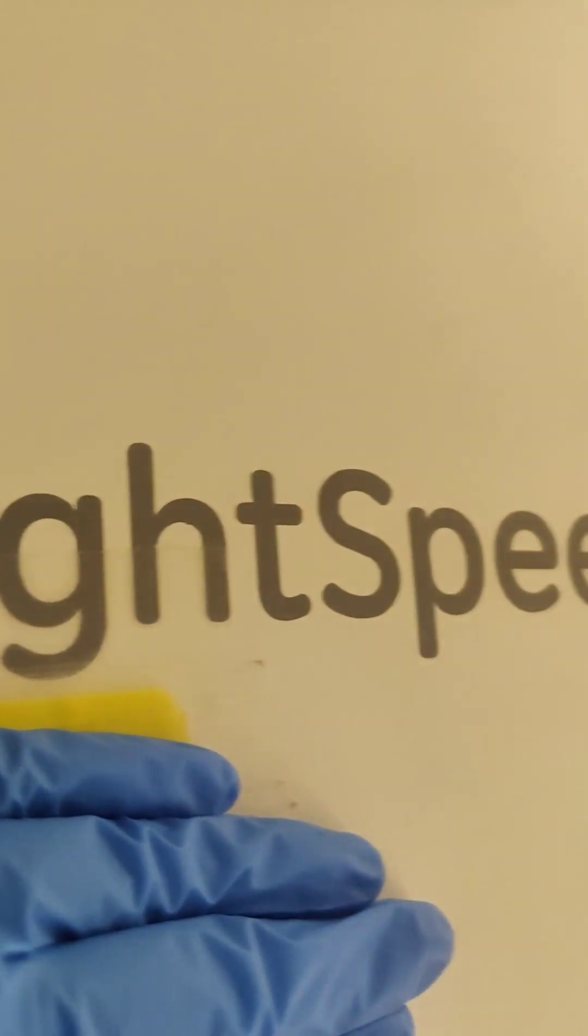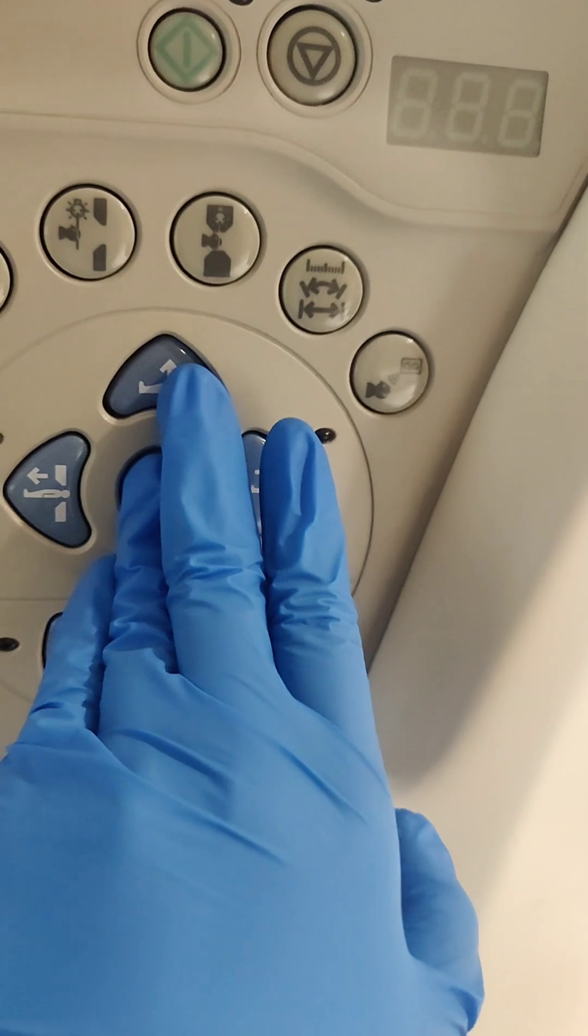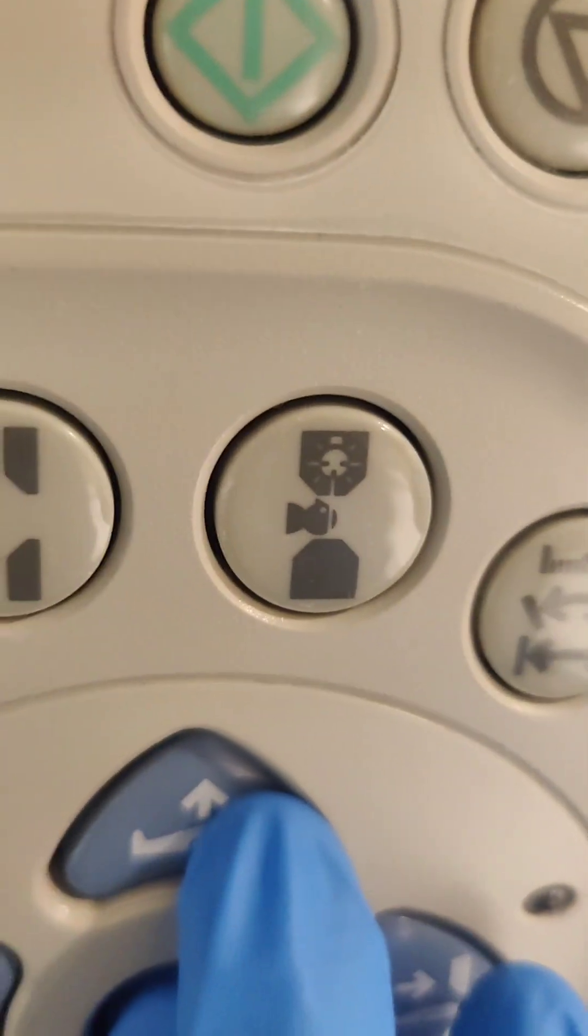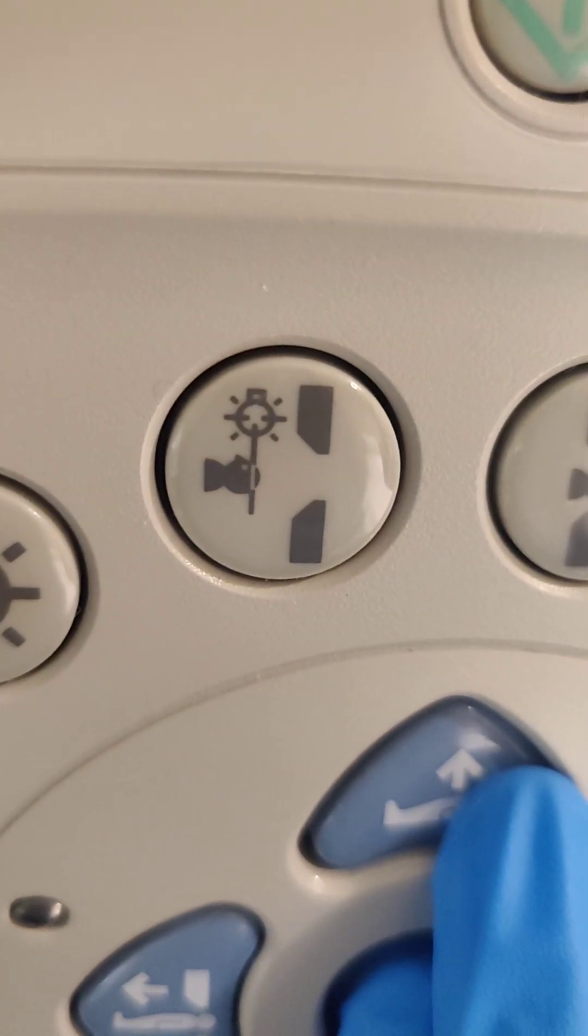Hey guys, let's take a look at this GE Bright Speed. I've had a lot of questions about inside light, outside light.